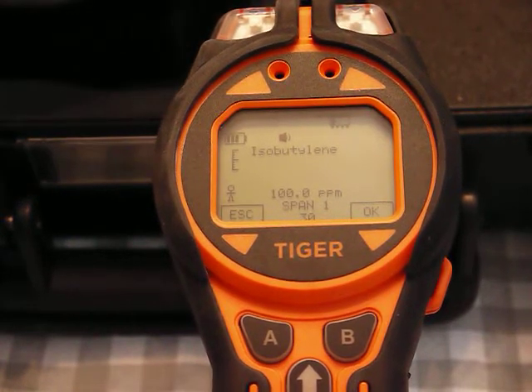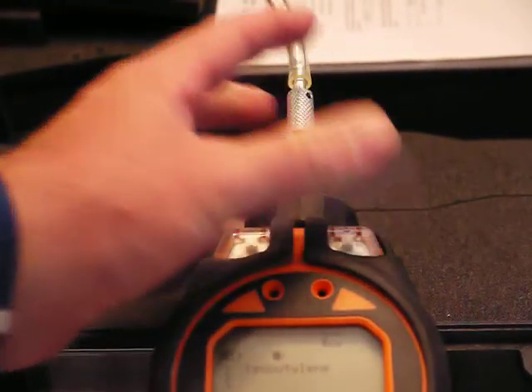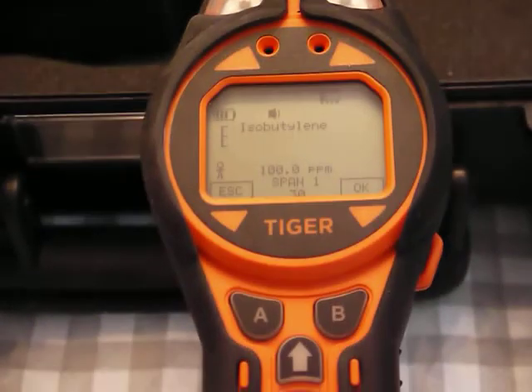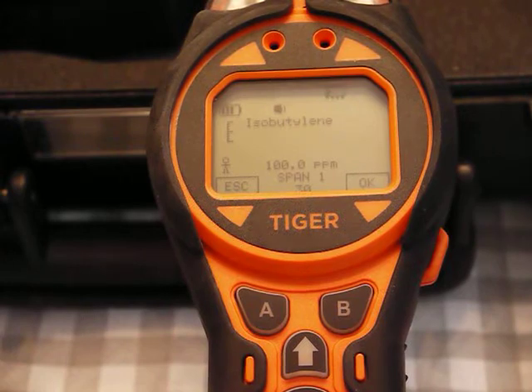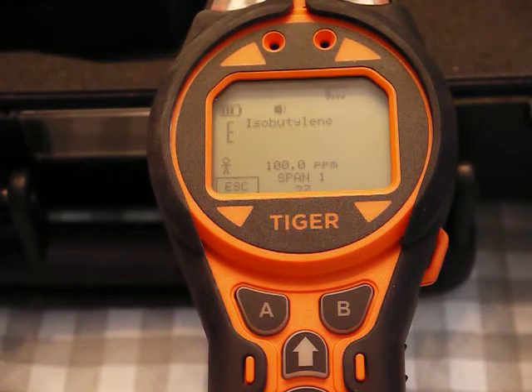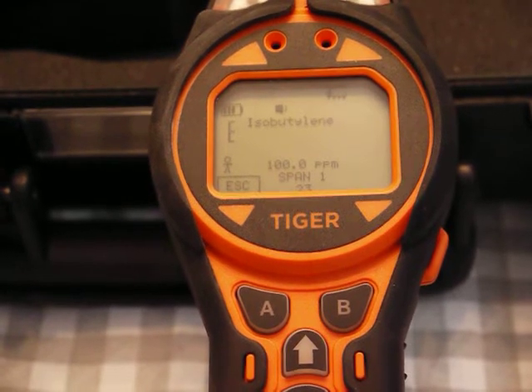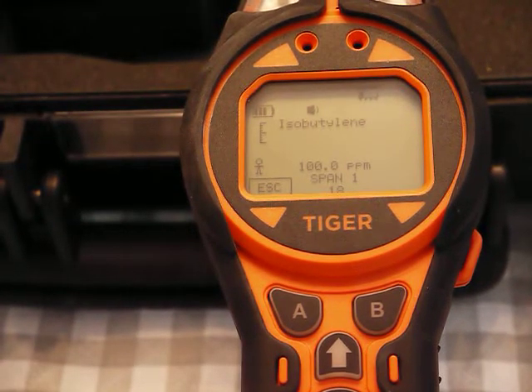I've got my 100 ppm span gas. I put it over the inlet fairly tight — the gas comes through those little ports so it doesn't pressurize the pump. I start the flow of gas and hit okay, and over the 30-second countdown the meter will try to get a steady reading on 100 ppm isobutylene.